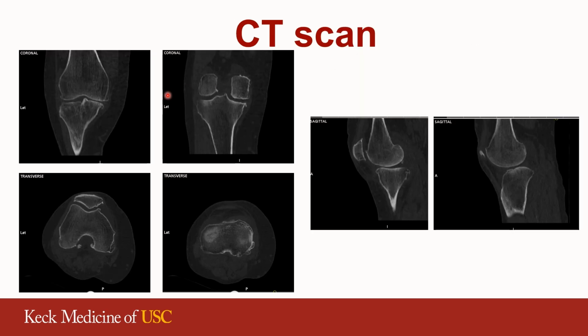The CT scan will allow us to characterize both the femur and tibia and the relationships between each other, and it will help us identify any type of deformity that we should be aware of so that we can position our implants properly for maximum contact and the best meeting between the femur, tibia, and patella joints.